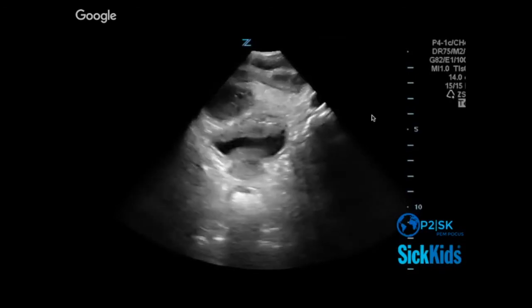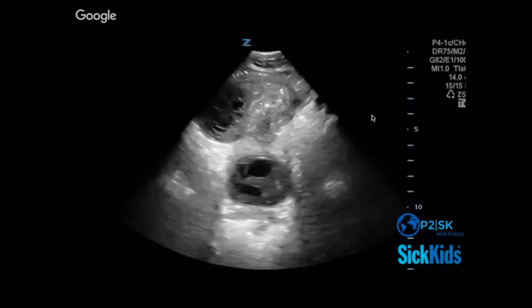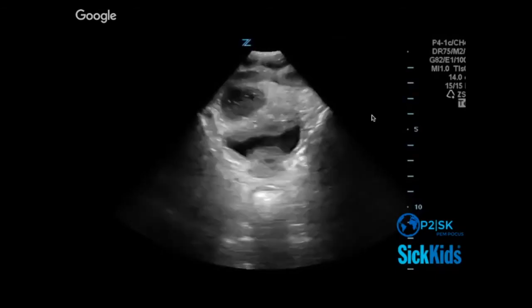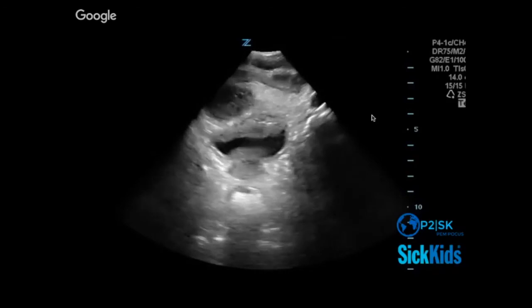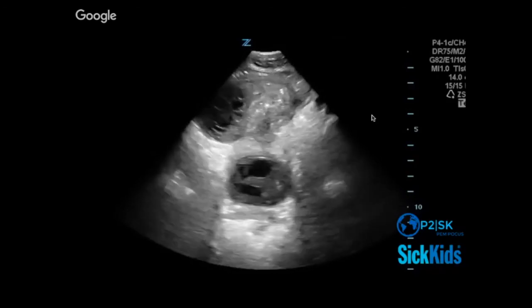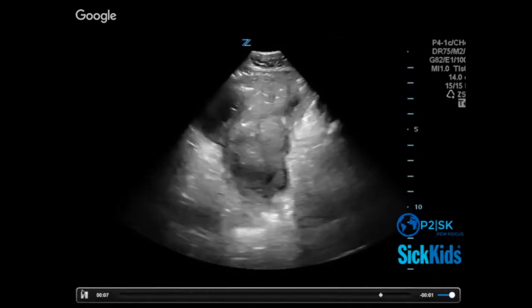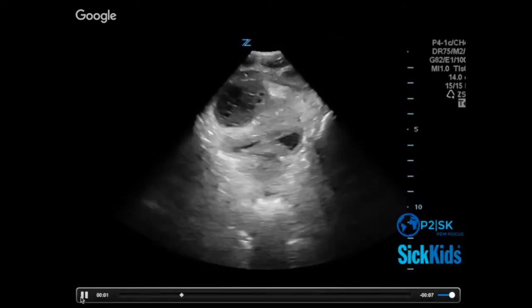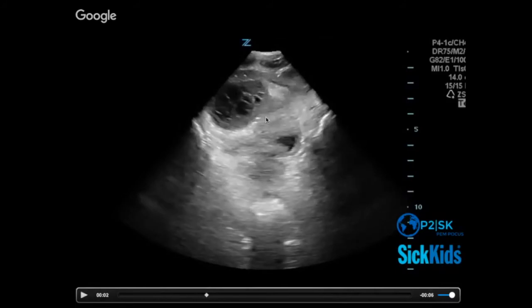That kind of unorganized, turbid, free fluid is one type of way that fluid accumulates. Organized is another. So the start of this clip, what do we got? Bladder. He just showed me this. I might be like, what's up with that person's big, bulky, torsed ovary?